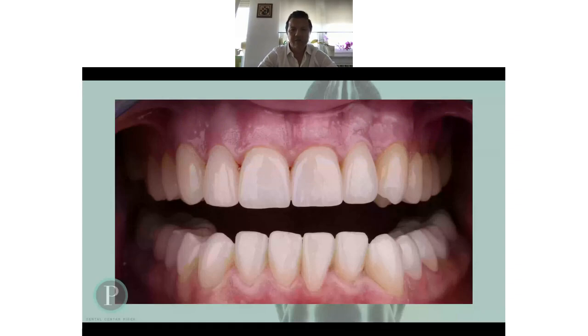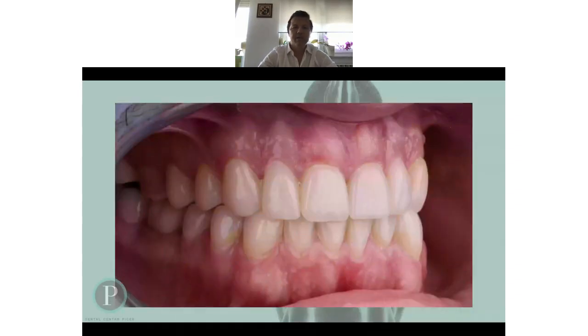So I'm very happy with this outcome, and so is the patient. In this case, as you see in this photo, we broke the crown 1/7, so this is what we cemented after. 1/6, as you see, is an inlay. The color is not the same, but the buccal surface of this molar was untouched. It was a little bit yellow, but he agreed it's not important for him to prepare the whole tooth.